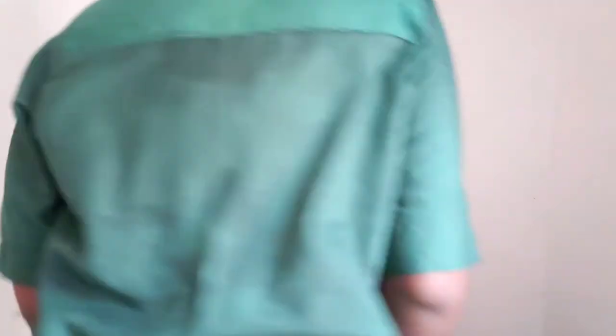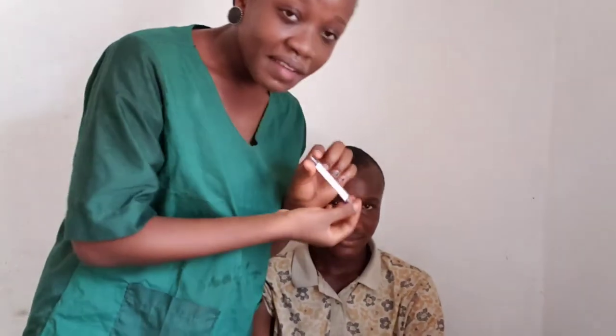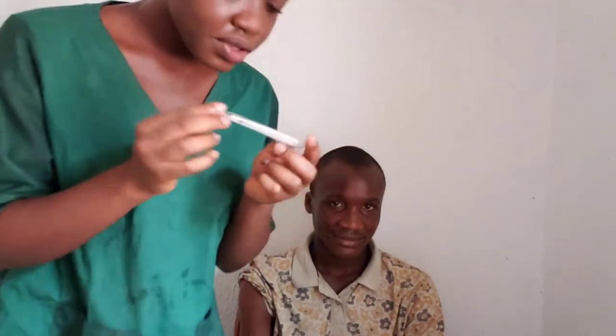When you check the temperature, you should always record what you get. Whenever you carry out any procedure, it is very important that you document it — documentation has its own mark. So I'm done with checking the blood pressure. Let me remove the thermometer. I have 37 degrees Celsius, so I'm going to record what I got.